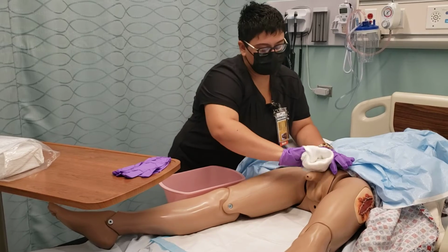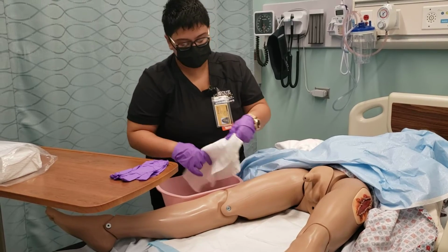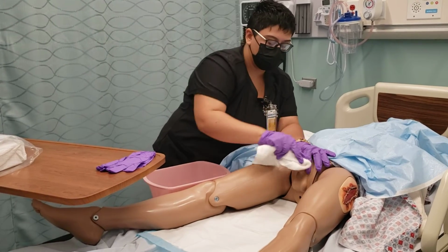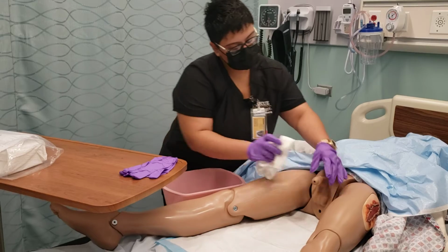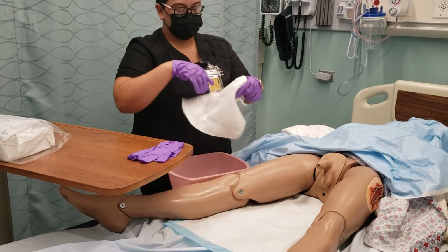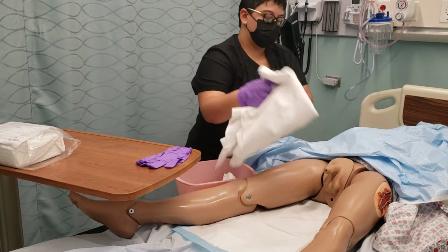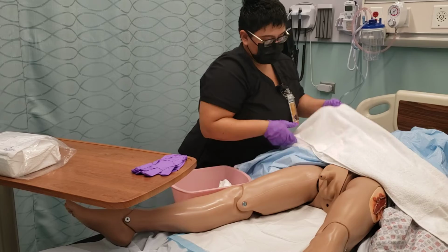Okay, just going to take and turn it downward, switching my cloth each time. Iodine. You have an allergy to iodine, okay? And then you draw the curtain and close the doors. You provide privacy and make sure the lighting is adequate. And around and down again. Adjust the bed to the workable height. And then just clean the groin area here. Okay. We will dry him off with a clean towel. And I will drape that over him for added privacy.